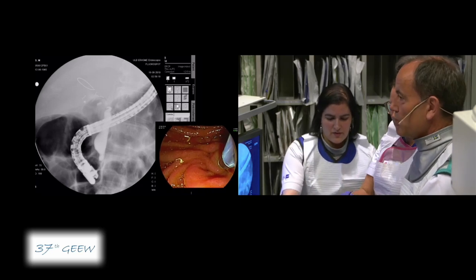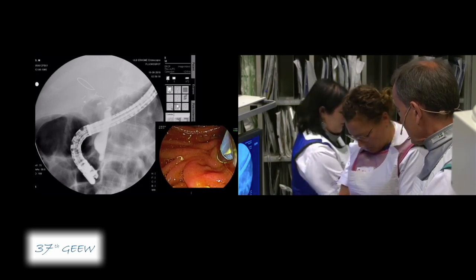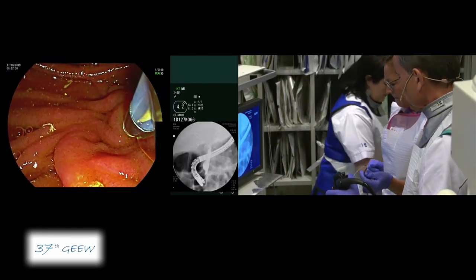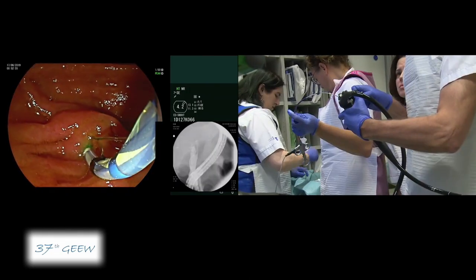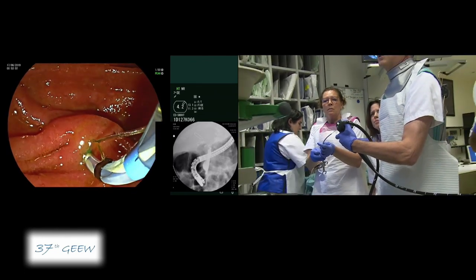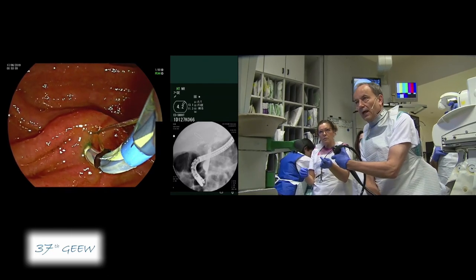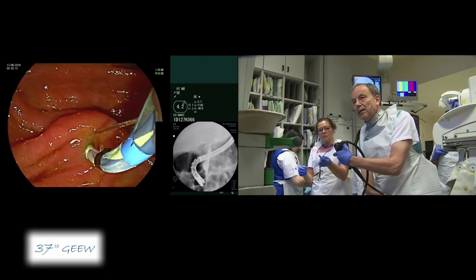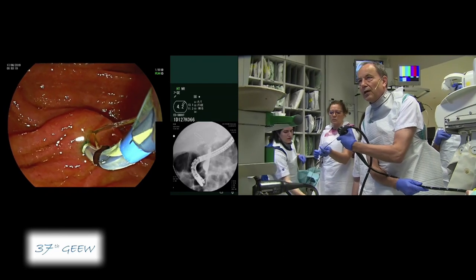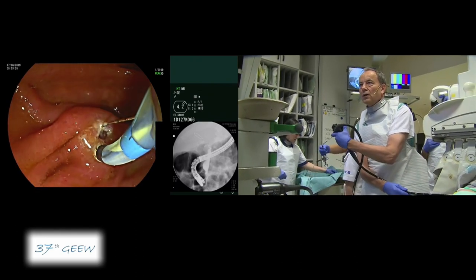The next step is sphincterotomy. I'm using the ERBE machine set to endocut I, selecting effect 1, duration 3, interval 3 — so we have minimal coagulation. As you can see, I have less than one-third of the cutting wire inside the papilla. When we see the greenish ring and we are in a good direction, I don't touch the catheter but manipulate the shaft of the endoscope like the handle of a surgeon's scalpel. With some tension on the roof and pulling the endoscope slightly, we cut in the 11 o'clock direction.